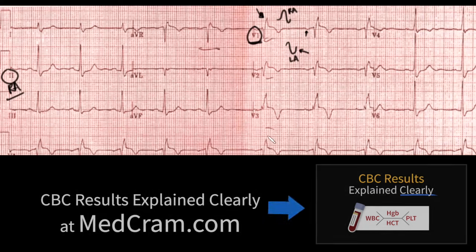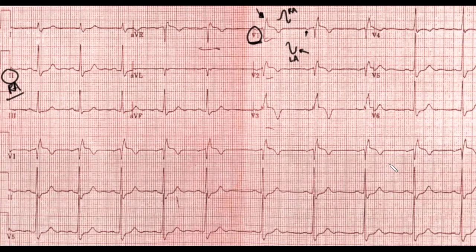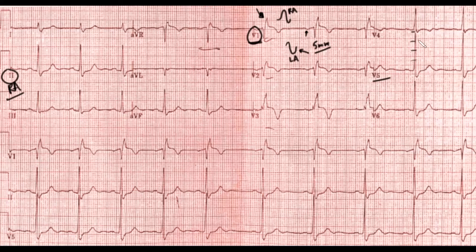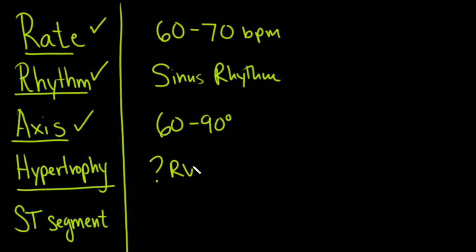It also looks like there may be a slight bundle branch block pattern. For left ventricular hypertrophy criteria, the S wave in V1 is about 5 millimeters and the R wave in V5 is about 20 millimeters, totaling 25. That's still below the threshold of 35 for LVH. So overall we have some questionable right ventricular hypertrophy.